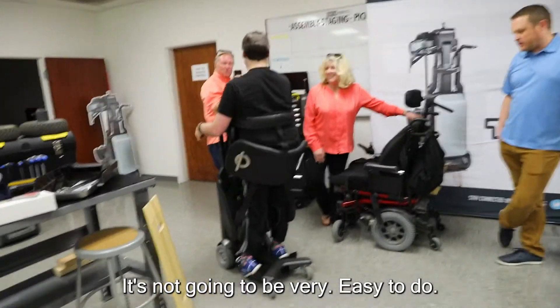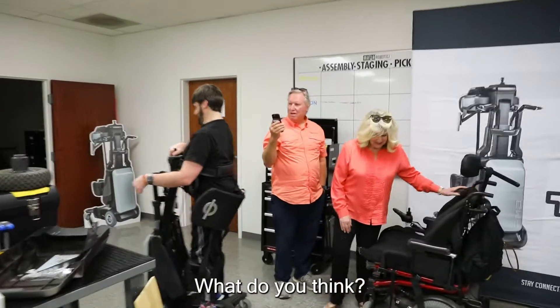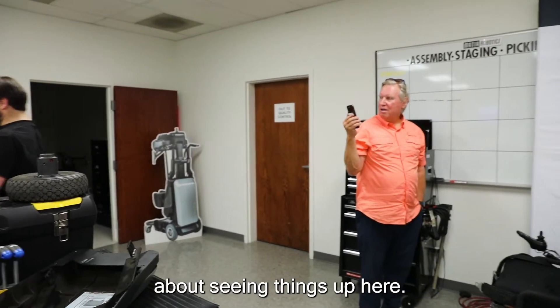Just in your daily use it's not going to be very easy to tip it. What do you think, Sam? What do you think? I wonder how his brain is feeling about seeing things from that height. One of the questions I'll always ask people is: when is the last time you stood up? And I've heard as long as 30 years.